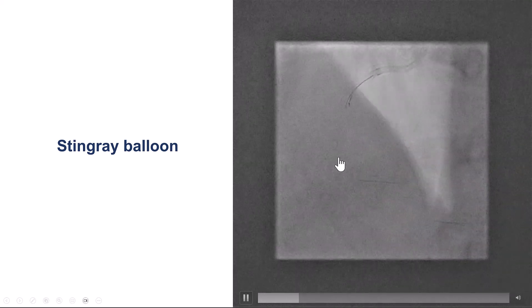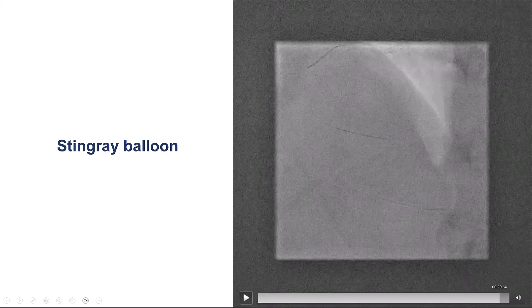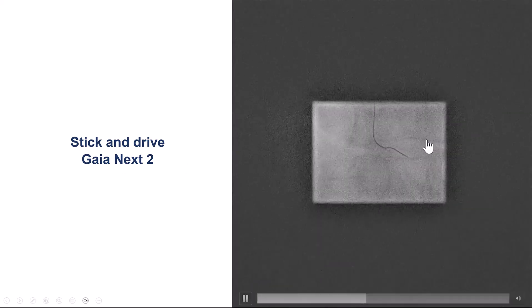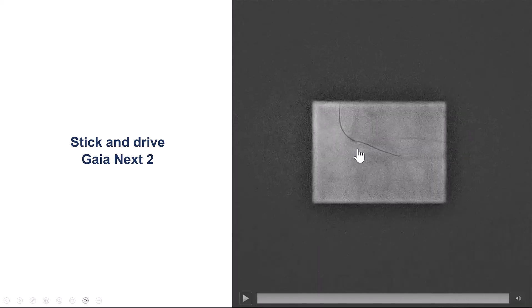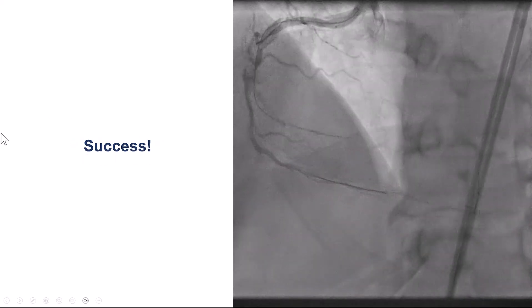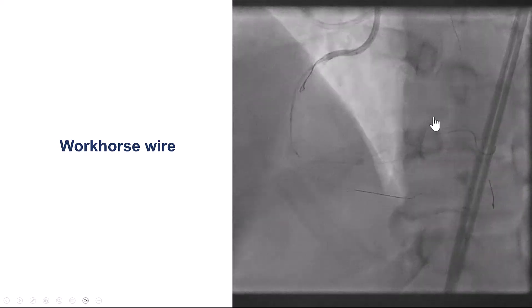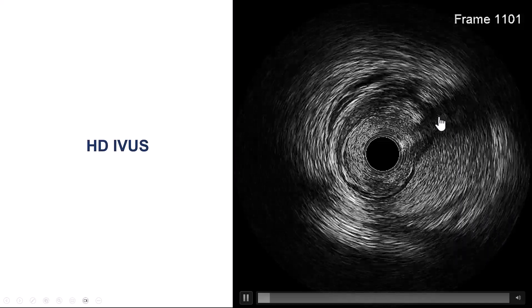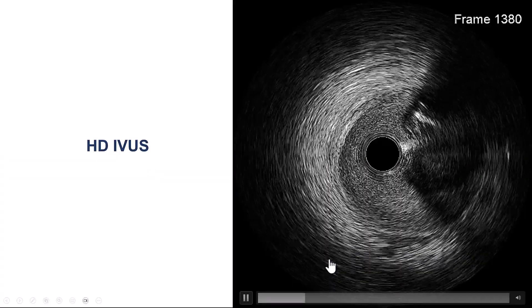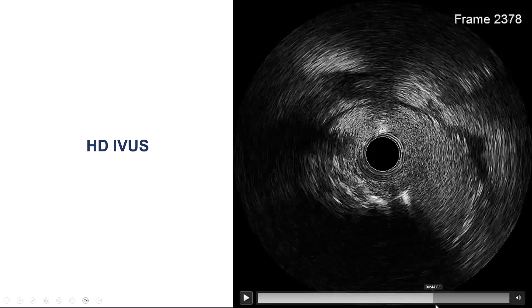We delivered a Stingray balloon all the way down to the re-entry zone, which wasn't difficult since there was no significant calcification. We performed re-entry with the stick-and-drive technique using a Gaia NX2. The wire exits the Stingray balloon proximal to the proximal marker and seems to track along the vessel course. We switched to a workhorse guide wire and performed intravascular ultrasound, confirming some extra-plaque hematoma distally but true-lumen position. A more prominent hematoma was visible proximally, with true lumen at 12 o'clock, and the proximal vessel confirmed in the true lumen.